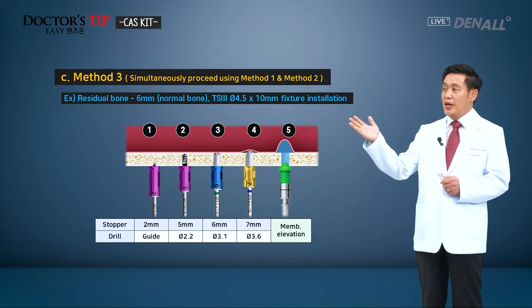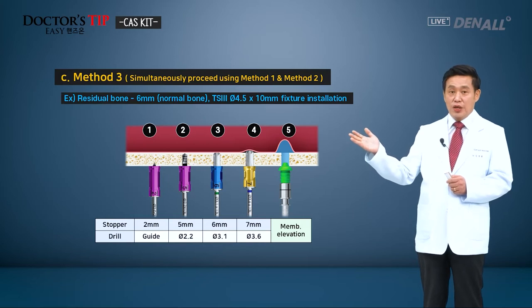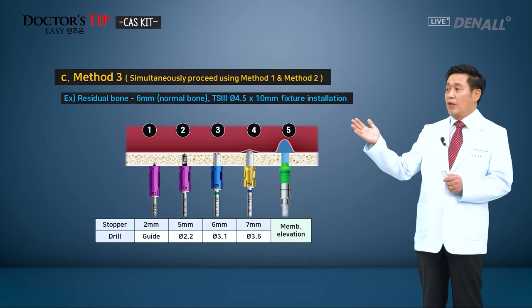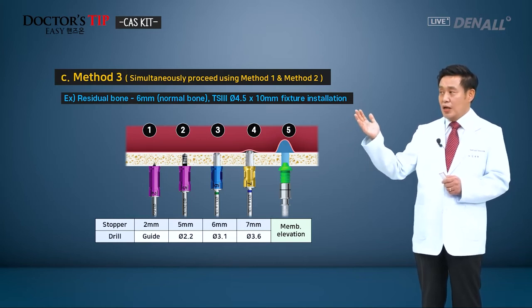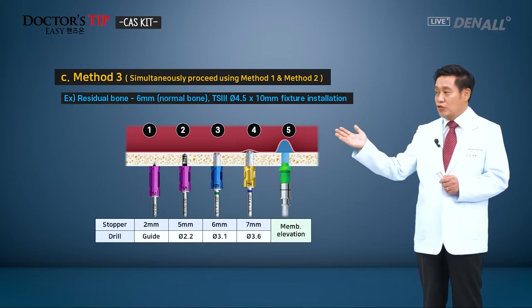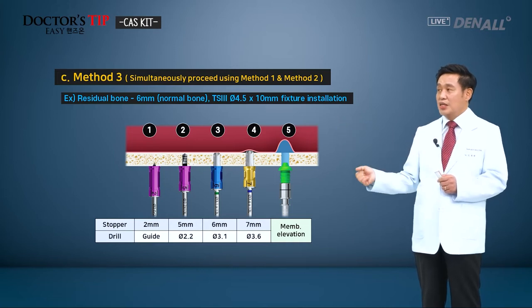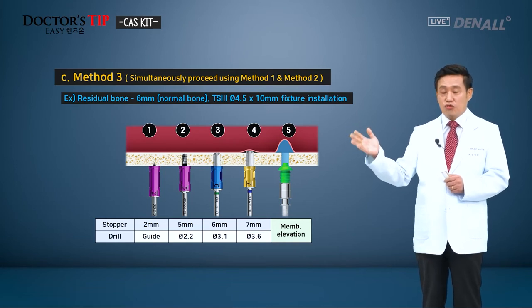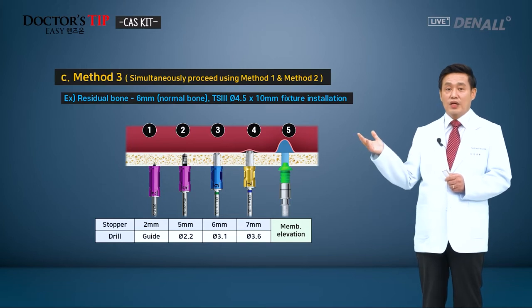Like this, at the beginning, 2 millimeter stopper is used for the guide drill, 5 millimeter, 2.2 twist drilling. After that, CAS drill 3.1 with 6 millimeter stopper, 3.6 wider diameter, and the longer length is used. Then the drilling sequence is simplified, followed by the hydraulic elevation of the membrane.